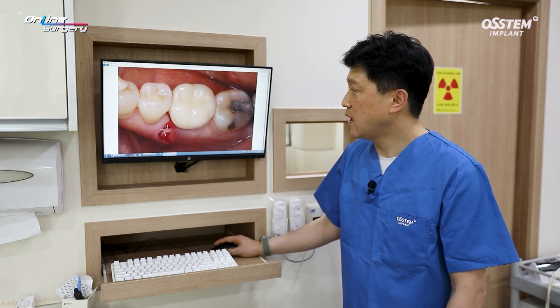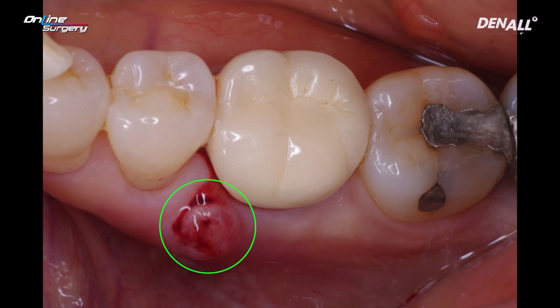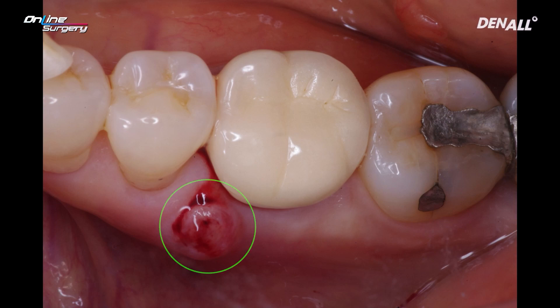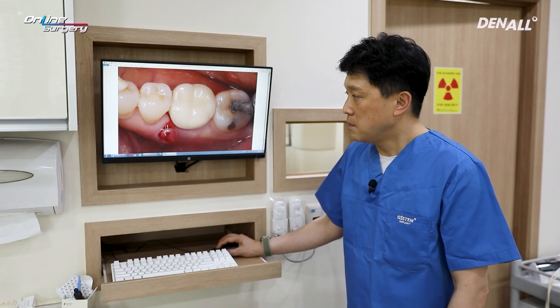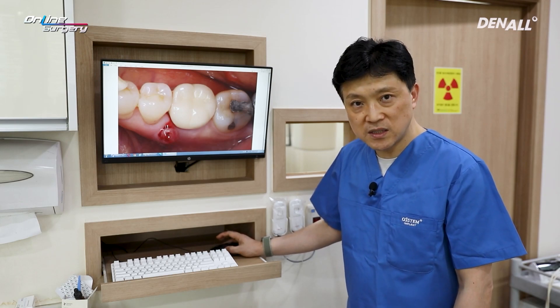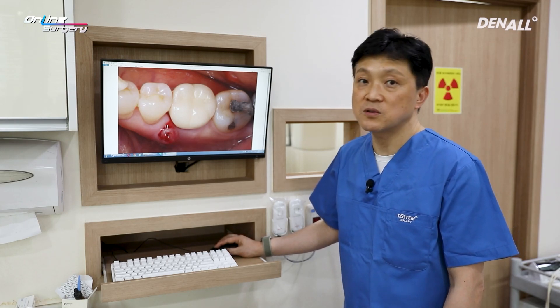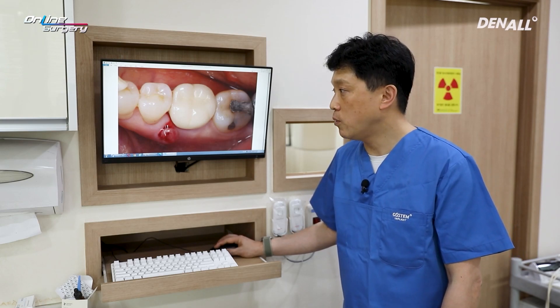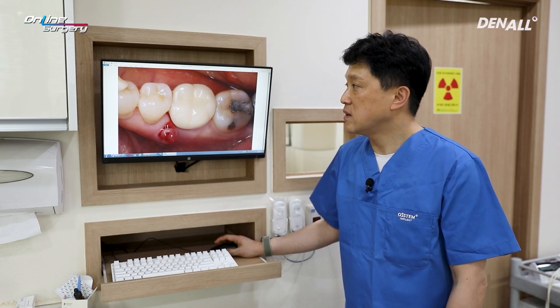This can be a bit of a pickle. If you look at this image on the mesial side, there is a gumboil and fistula tract. In this area on the mesial side, there can be fenestration or dehiscence defect — there is a high possibility of that.